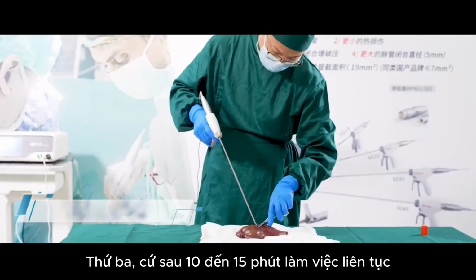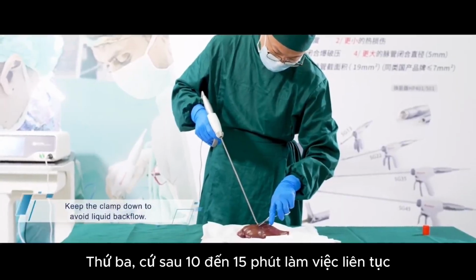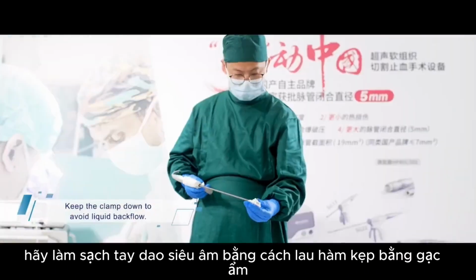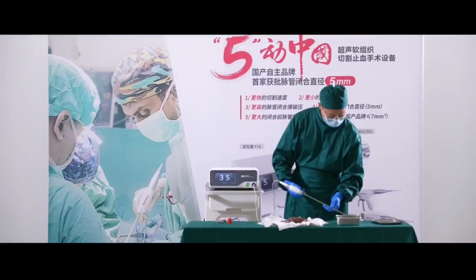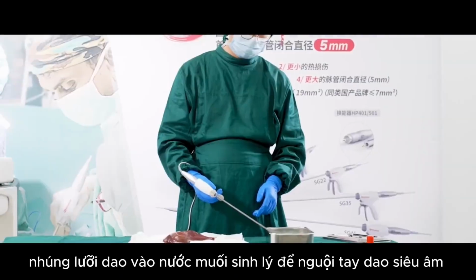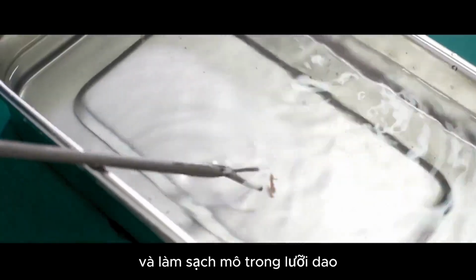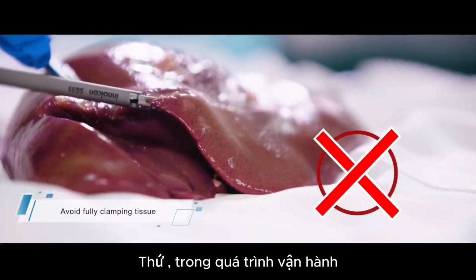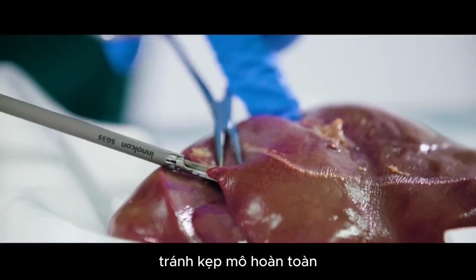Third, after every 10 to 15 minutes of continuous work, clean the scalpel by wiping the clamp with a sterile moist gauze. Fourth, immerse the blade into normal saline to cool down, and clean the tissue in the blade by activating the scalpel. Fifth, during operation, avoid fully clamping tissue.